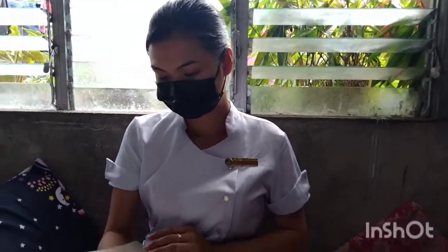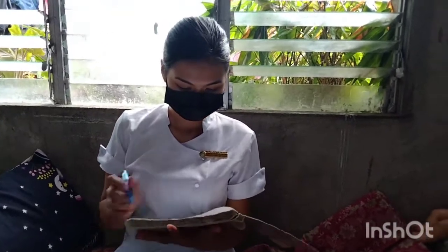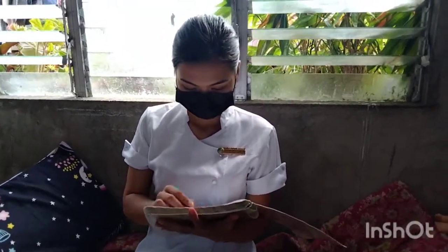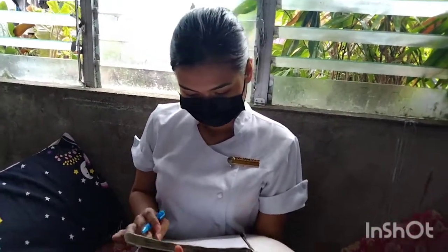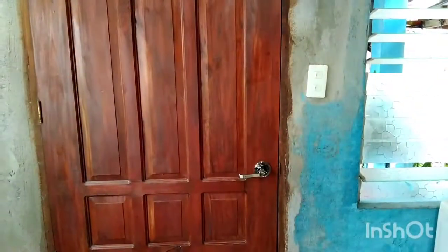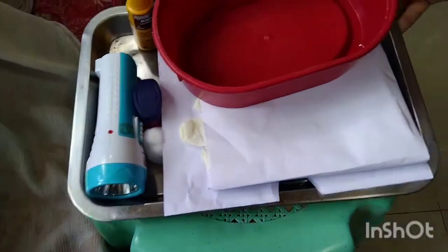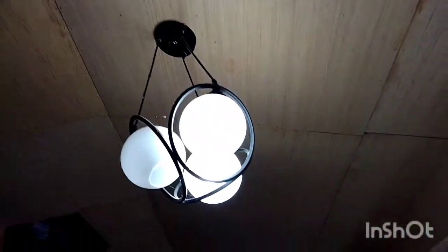Now, let us proceed to the procedure. Step number 1. In preparation of equipment, obtain treatment card from the nurse and check with doctor's orders. This helps to save time and effort. Step number 2. Bring equipment to bedside table. After that, check lighting source.